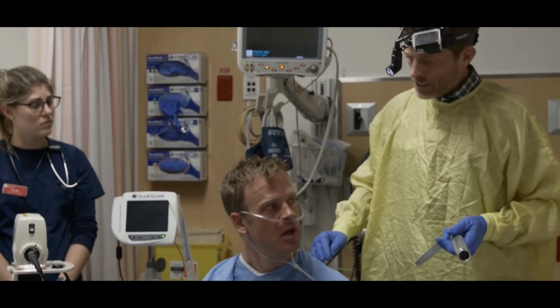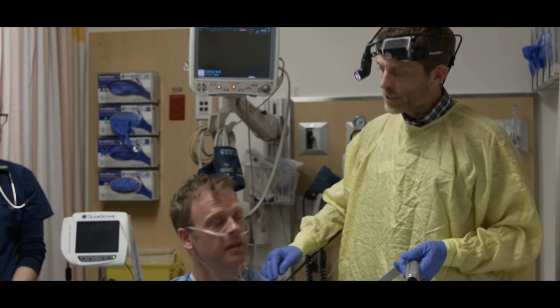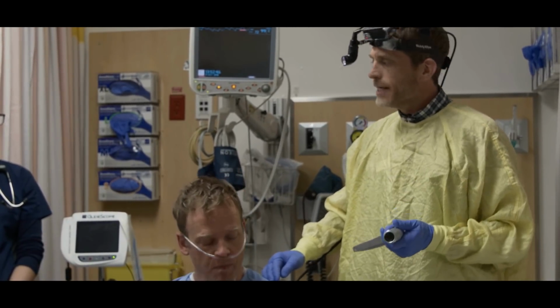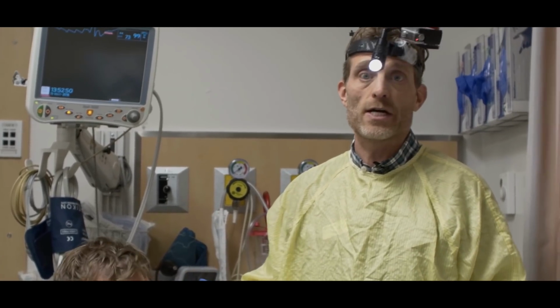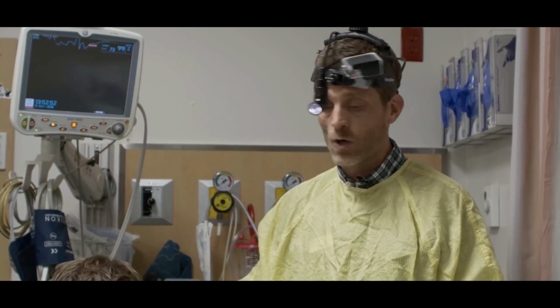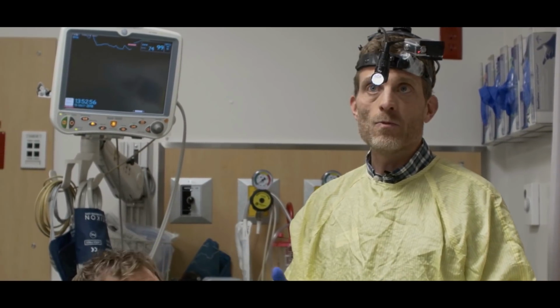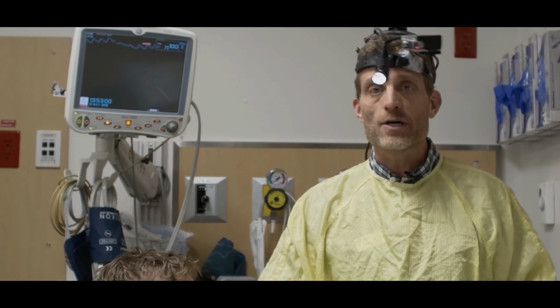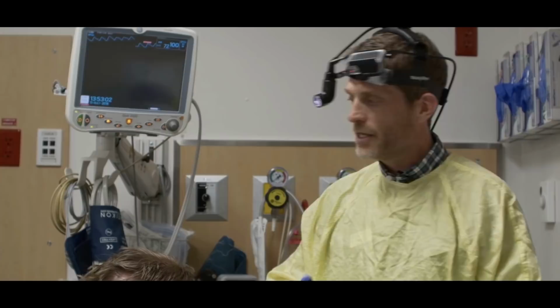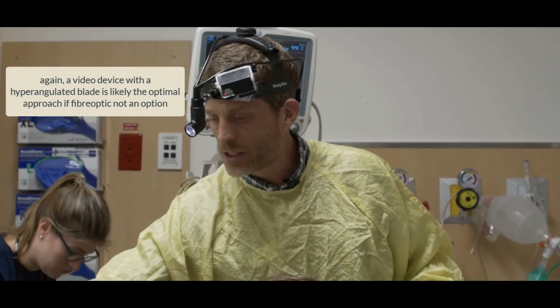Did you gag there, Chad? No, I didn't gag, but there was pressure that I didn't like. Pressure, yeah. Once you get the patient anesthetized like this patient's anesthetized, you can do this procedure however you like. So I think I could have intubated him right there with what we saw. But let's try the glide, because there'll be less pressure on the tongue and in the vallecula. And let's see what kind of image we can generate with the glide scope.